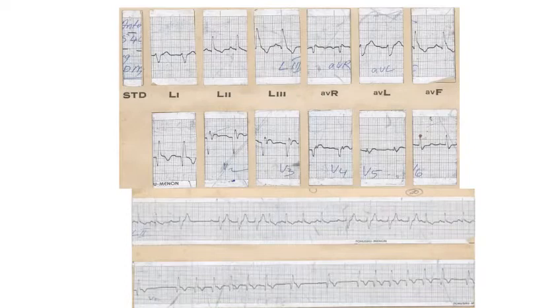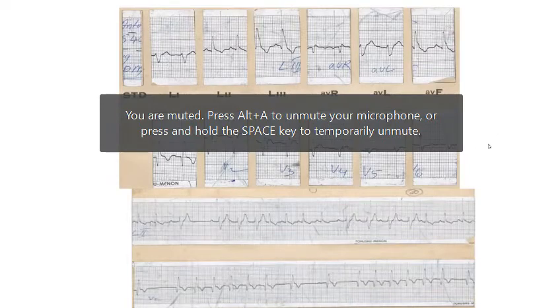The 12 lead electrocardiogram is not very difficult. You can start with the 12 lead electrocardiogram and then come to the rhythm strip. Any volunteers? Roshan? Would you like to try? Saroj, would you like to try? Yes, sir.